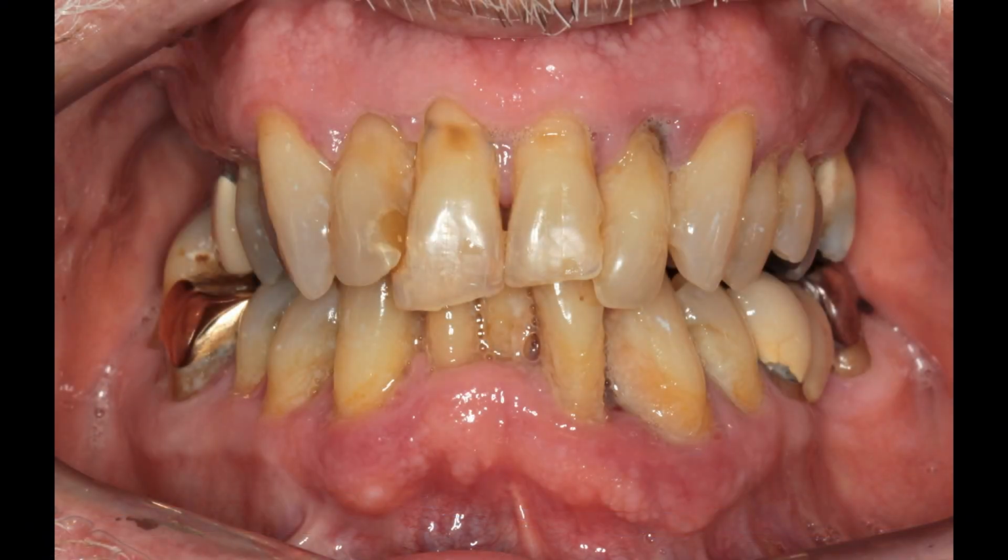Here's another patient with what we call terminal dentition, a person who's been putting up with failing teeth for most of their adult life, finally decided it was time to do something better. But the interesting thing about this case that I'll point out from the very beginning, you'll notice how long his teeth are. That means he's lost bone and had gum recession.